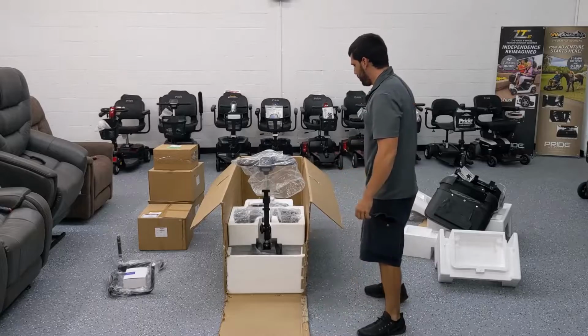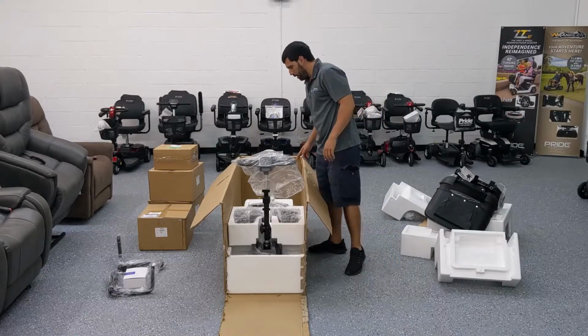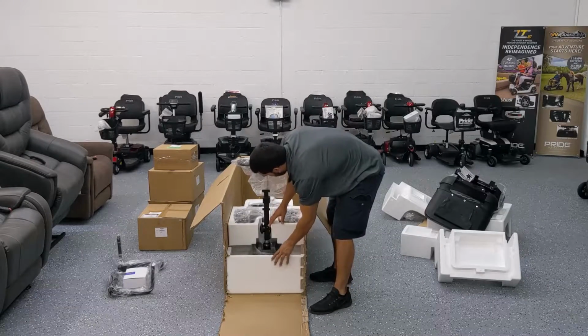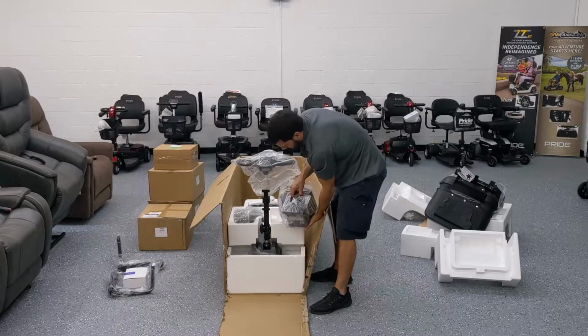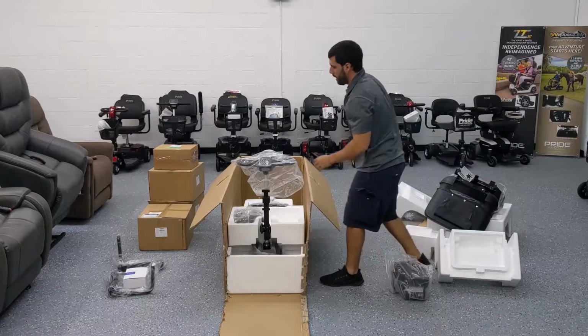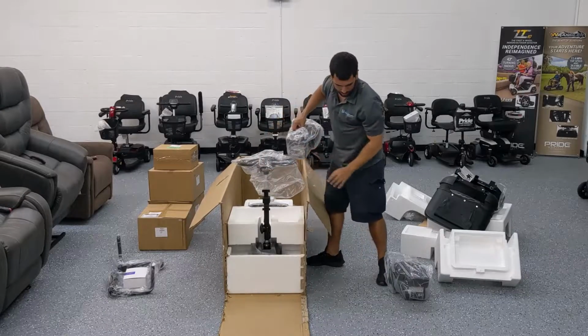Now the front is pretty much exposed, and we're almost ready to wheel it right out. I would say the next thing that you want to do is kind of get the battery boxes out of here, which are right in the front. You can pick it up with the handle, and it's going to make everything easier to get out. Get the other one on the right side here.